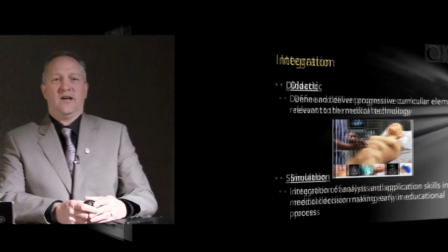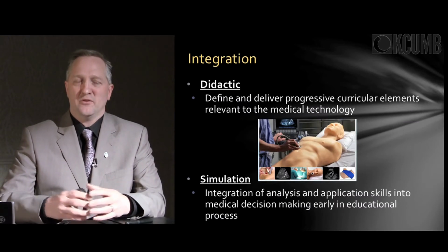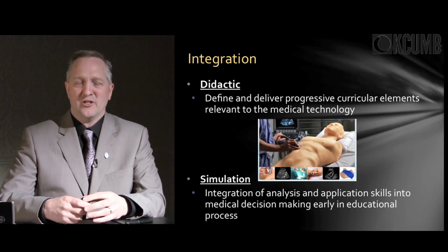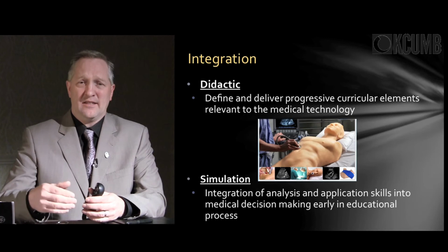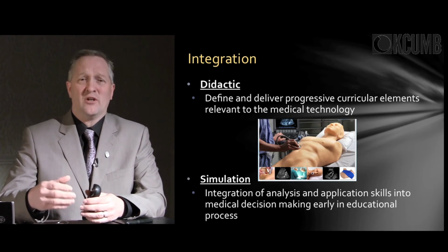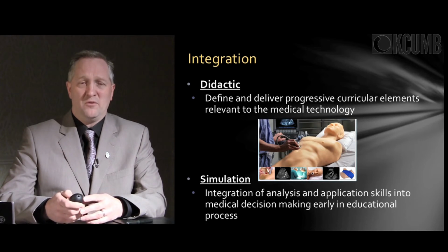We also have, within the didactics, to have a progressive curriculum. You want to begin to slowly introduce the concepts and the information, and there are available now simulation manikins that you can ultrasound and consistently have the same results for every single student. And those are becoming more and more widely available. There is some expense associated with that. That will be a direct expense. That's something you're going to want to consider as you're making the decision process of going into ultrasound.